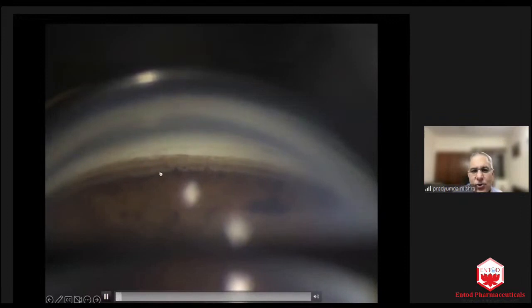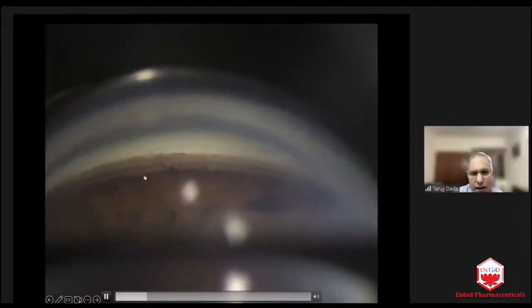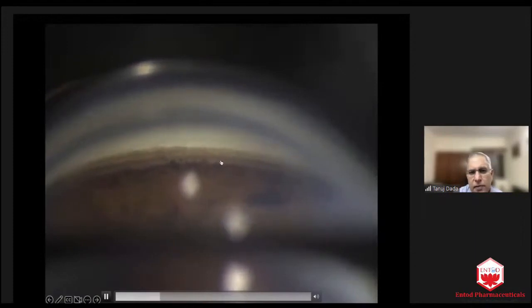Sir, I can see the scleral spur, the posterior pigment epithelium, the anterior pigment epithelium, and the non-pigmented epithelium, and the Schwalbe's line, sir. No, not pigment epithelium, trabecular meshwork, pigmented trabecular meshwork. Yes, sir. Very good. So this is open angle, because the scleral spur is visible and the pigmented part of the trabecular meshwork is visible. So the diagnosis is open angle type of glaucoma.